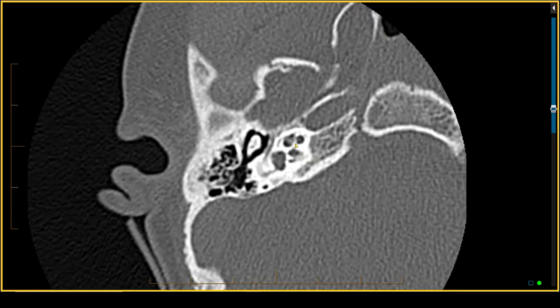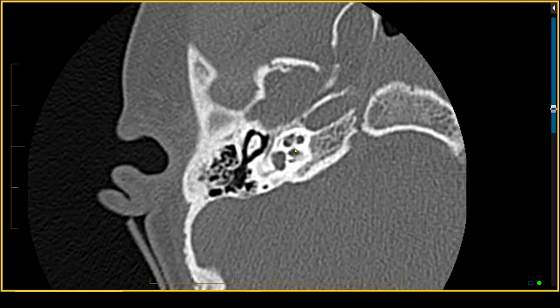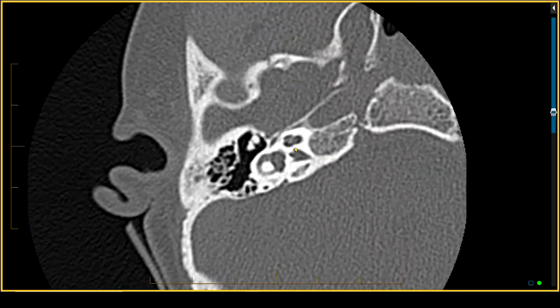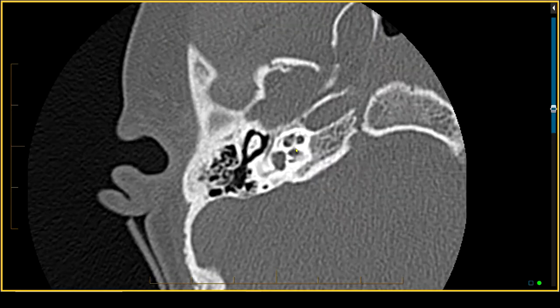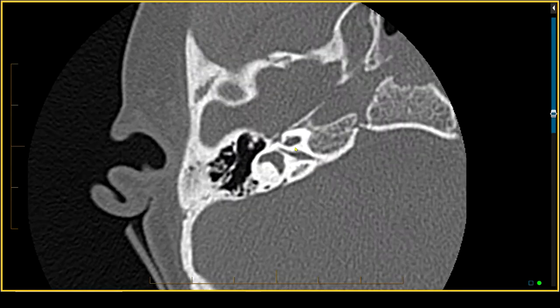That 1.5 millimeter threshold is measured right at the aperture. Another thing to note is that you can have a bony block in the middle of a relatively normal caliber aperture and we would still call it bony aperture stenosis. In this case we have a really tight, narrow aperture.